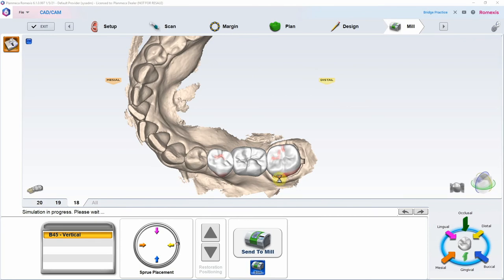This is also when the software generates your connectors — they're not generated nor editable in the design software. The software automatically does connectors, but things you do in your design will help make thicker connectors: make long, broad contacts, and slightly over-contour the gingival embrasure space. Usually takes about three to five minutes depending on your computer speed to do a quality sim on a three-unit bridge.